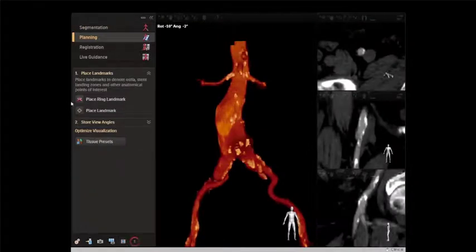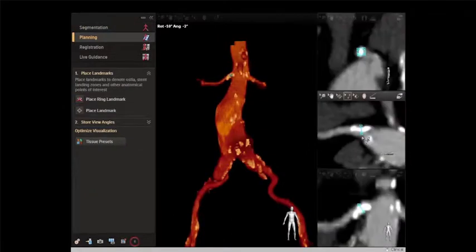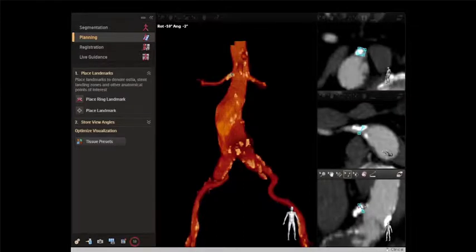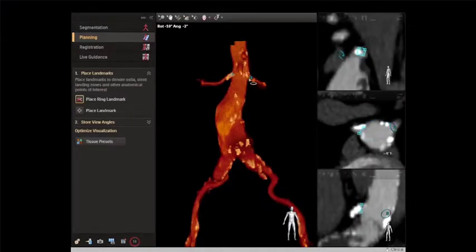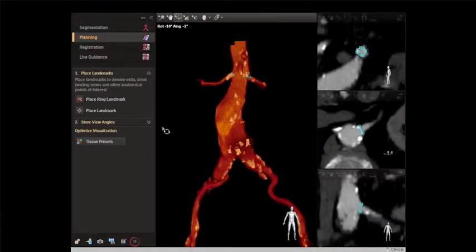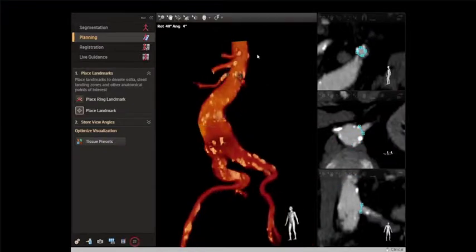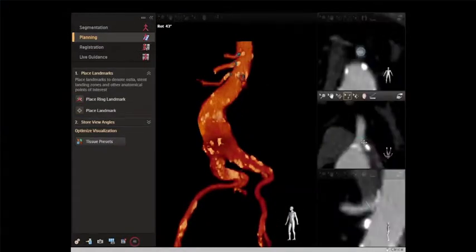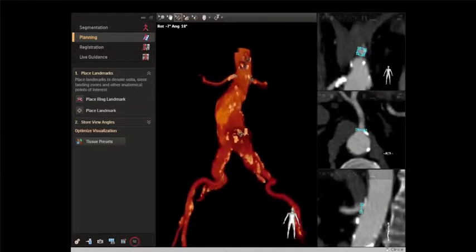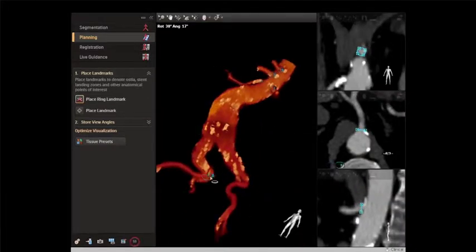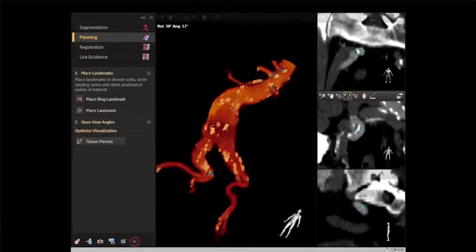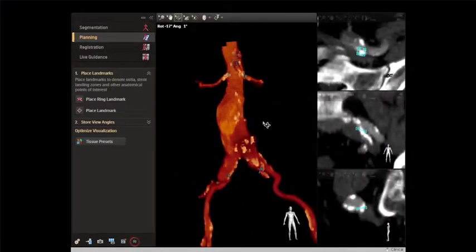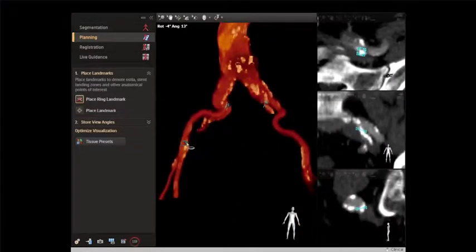We then move on to step two, the planning stage. We place ring markers at the origin of each of the branch vessels of interest. On the right, you can see how we can make fine-tuning adjustments to get them right up against the aortic wall. We do these at the renals, the viscerals, the hypogastrics, and also at the femoral bifurcation to help us stay above that with our puncture.